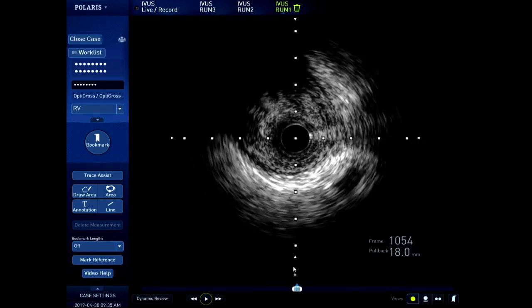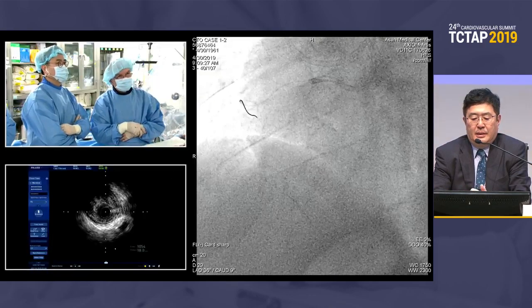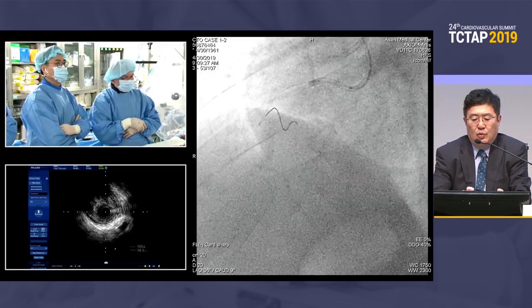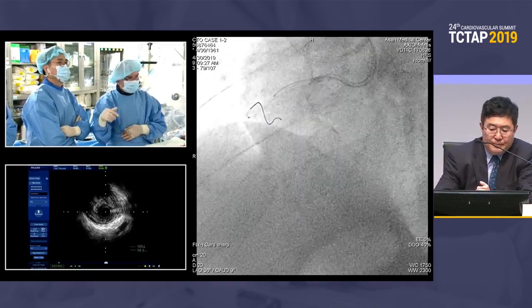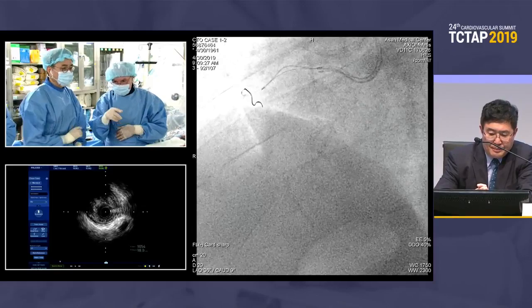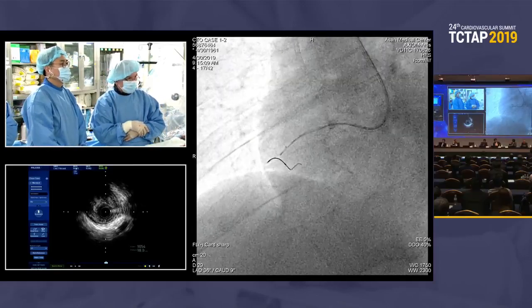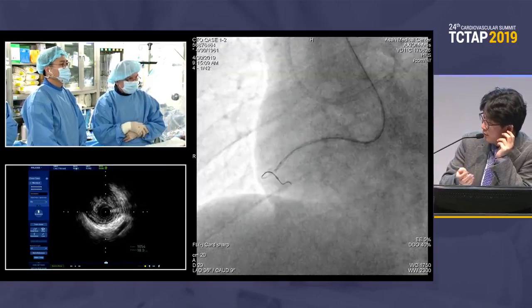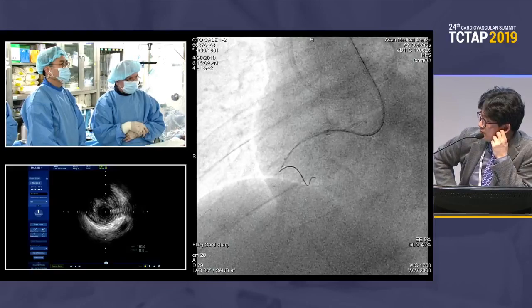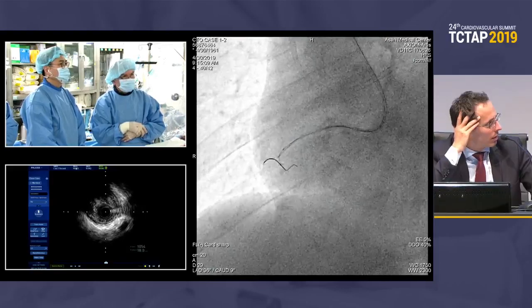Most of the time I start with an XTR. Okay. And then I move to the Gaia family or Miracle 3 or UB3. Next, fluoro. So, Campus, what will be your first choice? You have other options. There's no less calcium in the cap, you know. Yeah, I think we can also try with XTR short tip, and if this doesn't work, step up to Gaia second.